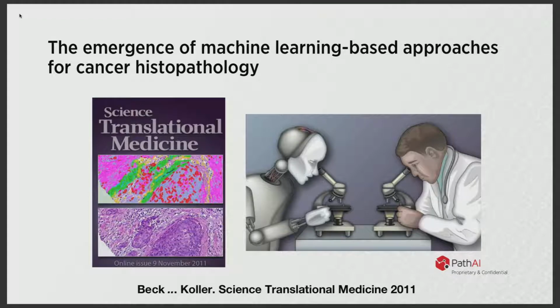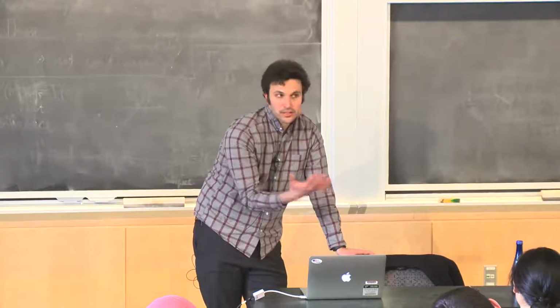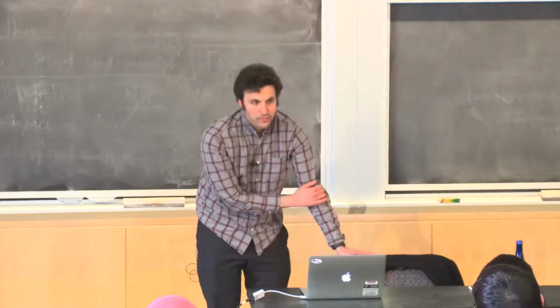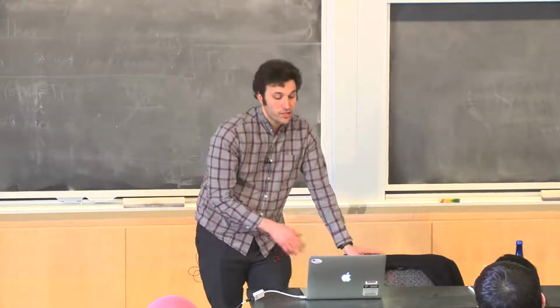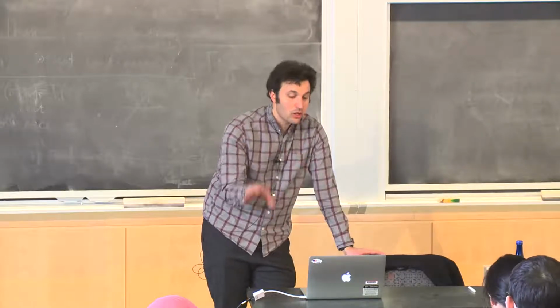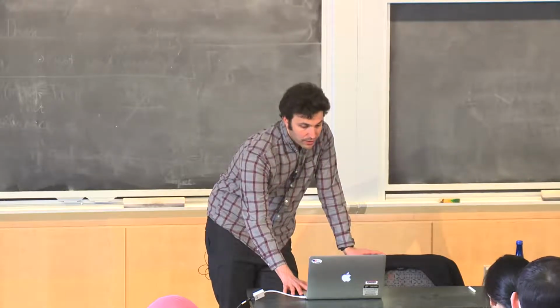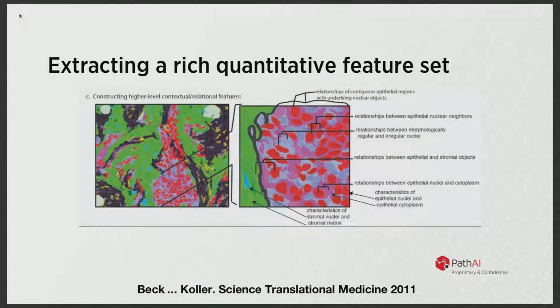But as was mentioned earlier, I was part of one of the first studies to really take a more machine learning approach to this. And what we mean by machine learning versus prior approaches is the idea of using data-driven analysis to figure out the best features. And now you can do that in an even more explicit way with machine learning. There's a progression from measuring one or two things in a very tedious way on very small data sets to, I'd say, this way, where you're using some traditional regression-based machine learning to measure larger numbers of features, and then using the associations of those features with patient outcome to focus your analyses on the most important ones. And the challenging machine learning task here, and really one of the core tasks in pathology, is image processing. So how do we train computers to have the knowledge of what is being looked at that any pathologist would want to have?